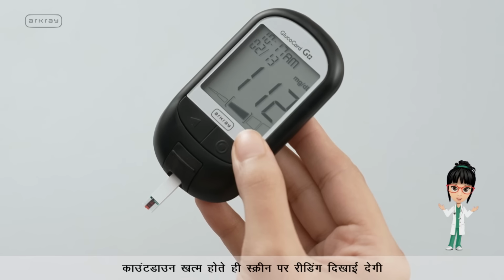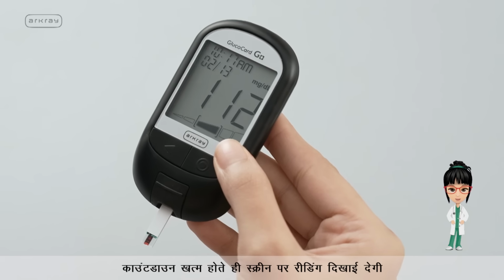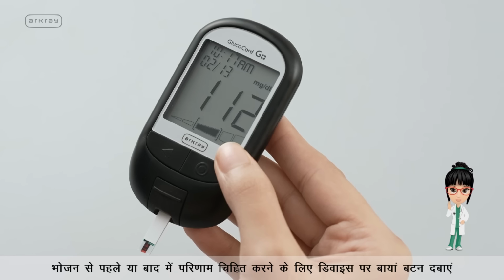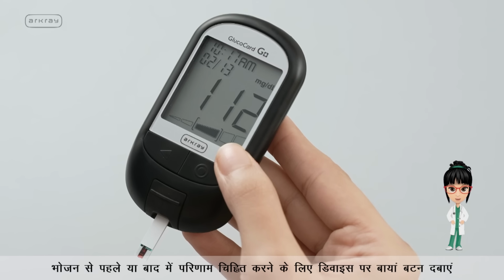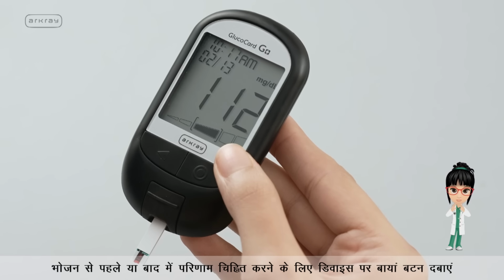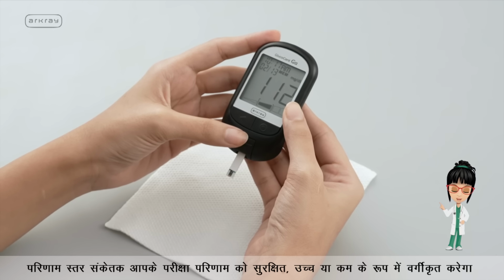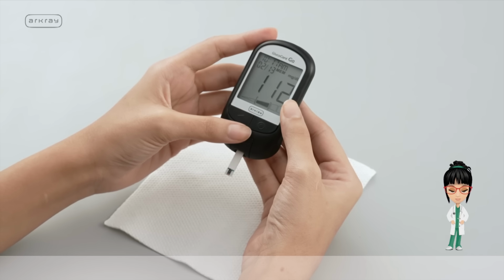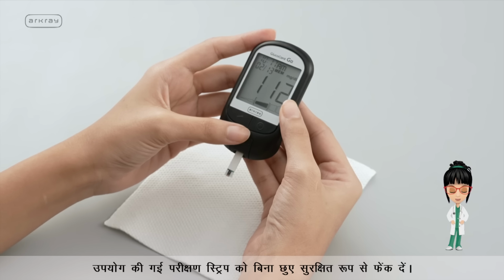The reading will appear on the screen as soon as the countdown ends. Press the left button on the device to mark whether it is a before or after meal result. The result level indicator will classify your test result as normal, high or low. Dispose of the used test strip safely without touching it.